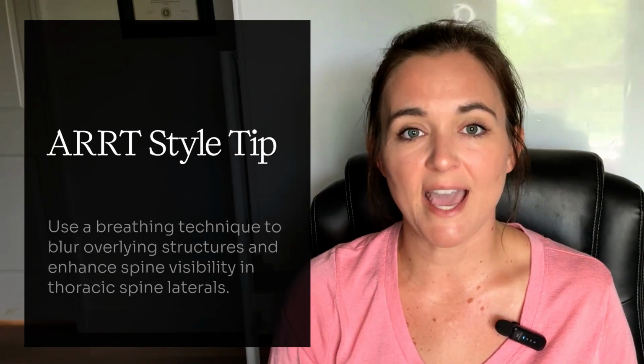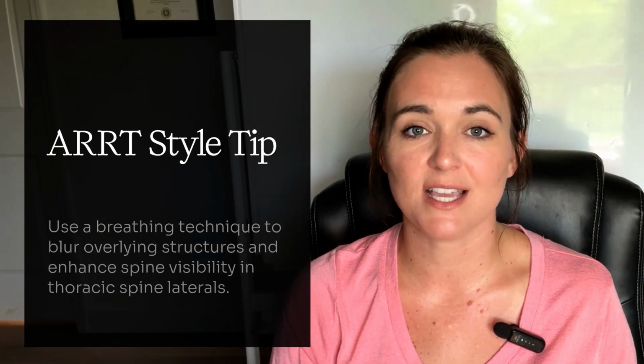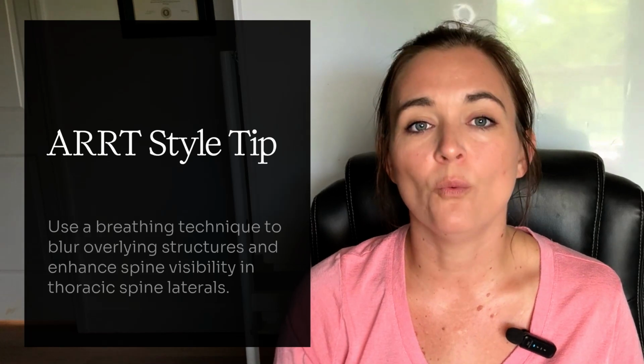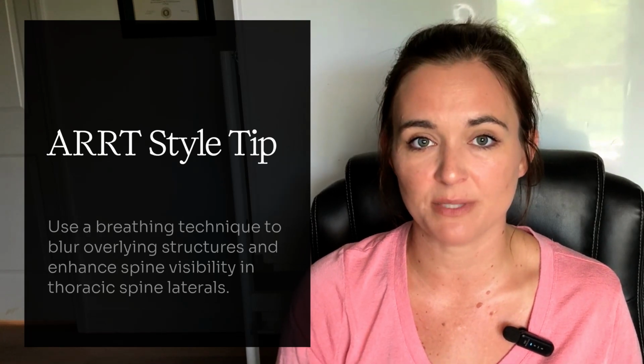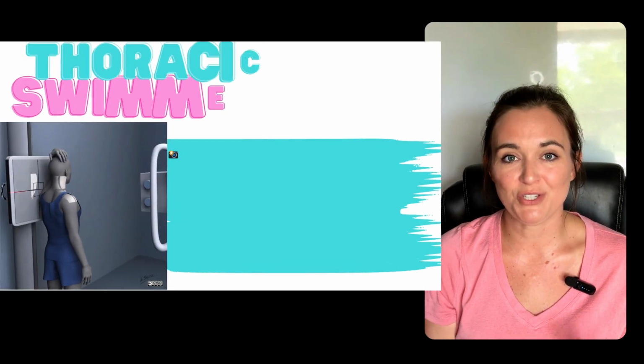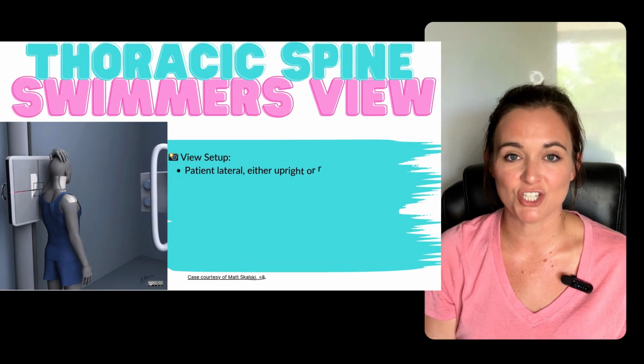If the question asks when to use a breathing technique, the answer is to blur overlying structures while enhancing spine visibility, especially in thoracic spine laterals. The swimmer's view, C7 to T1 junction.